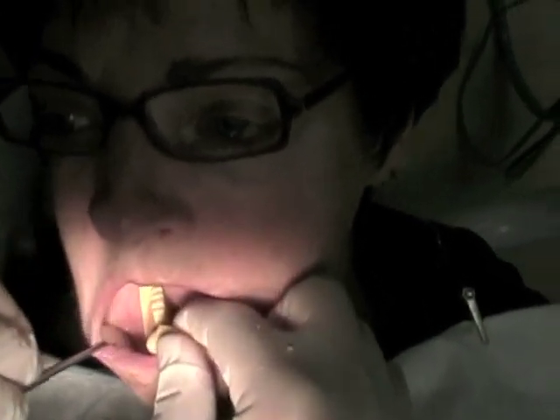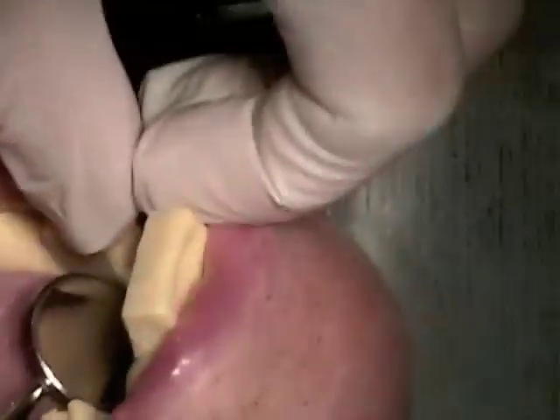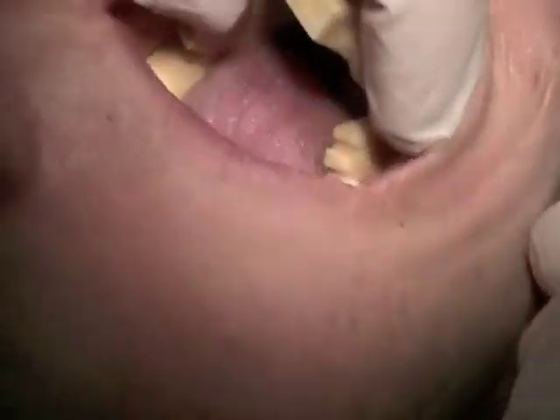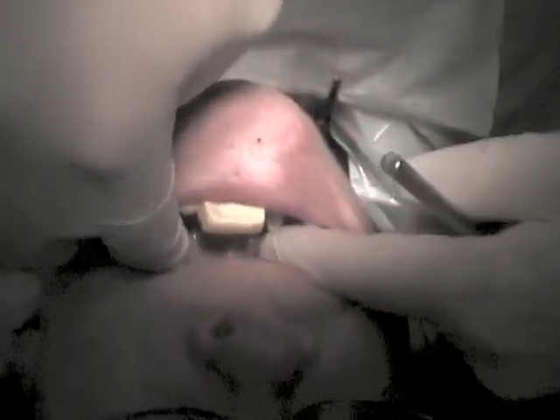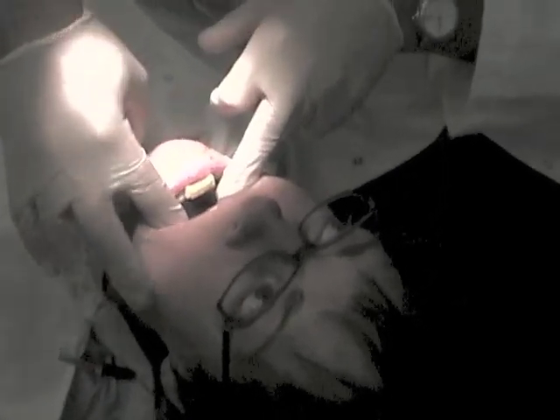Here we are trying the tray back in the patient's mouth to ensure there are no overextensions. In the mandible, the area that requires a little more extra time is the lingual vestibule. You have the lingual frenum that is in the way and you have to make sure there is room for that. There are special movements we will have the patient make with their tongue — lifting their tongue up to the roof of the mouth, sticking their tongue out forward, and licking their top lip from side to side — making sure that the tray doesn't move during these functional movements.